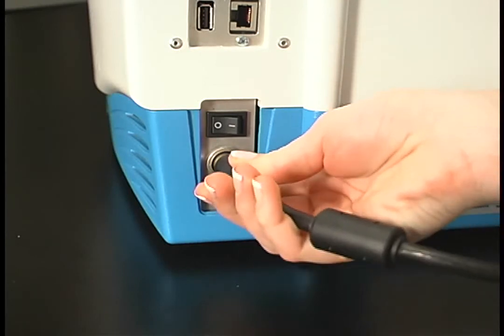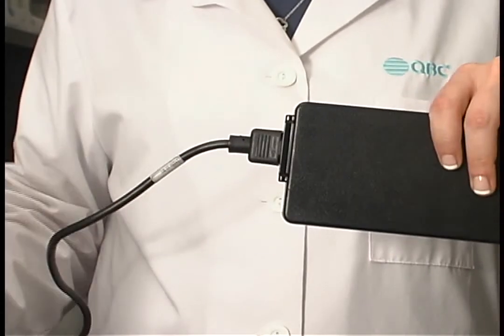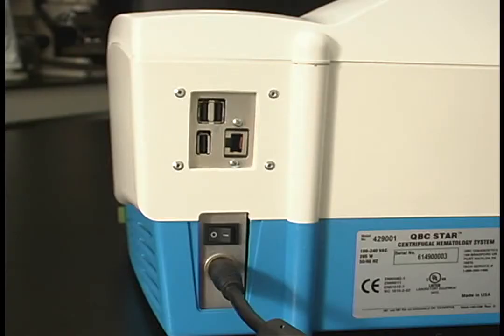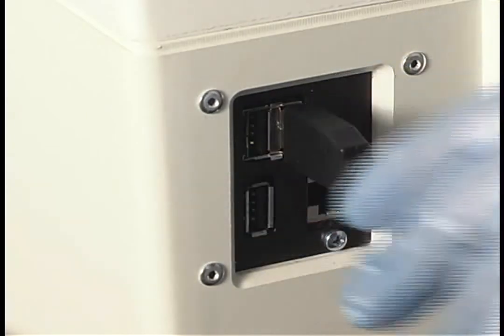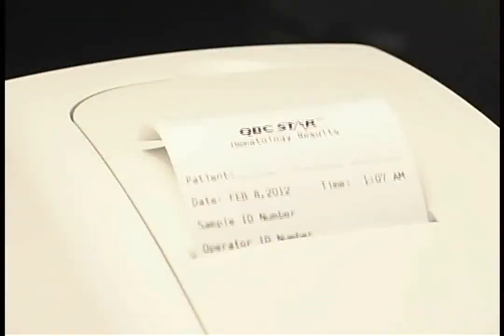Locate the external power supply and connect it to the back of the STAR. Next, connect the line cord to the external power supply and plug the pronged end into a three-pronged grounded outlet. If you'd like to connect a USB keyboard to your instrument, you may do so at this time. Use of the keyboard is optional and allows you to enter patient and user information that will print out on your test results.